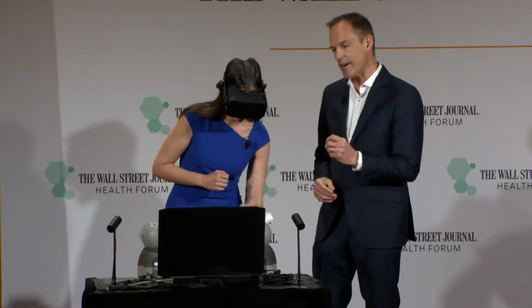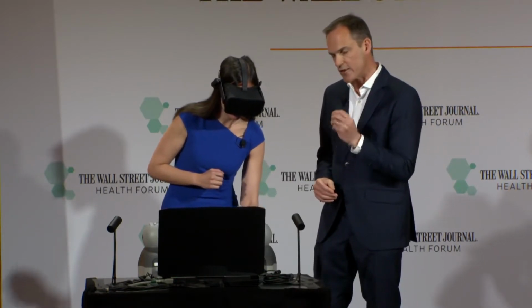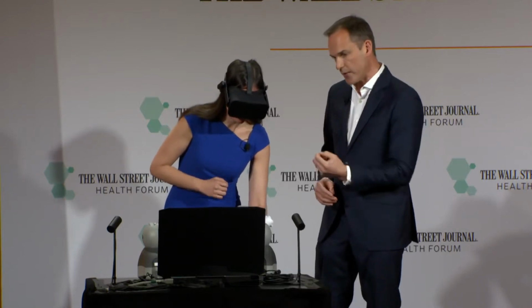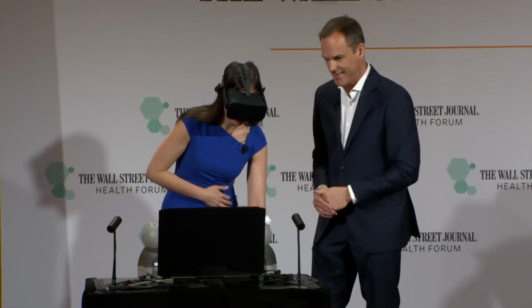So the key thing here is as you ream the acetabula, you feel the resistance change. It starts to go smooth. So you'll feel that as you start to push through. So if we didn't have the haptic feedback, we wouldn't have the ability to do that. Please go ahead. Should I go for it? Yeah, go for it.